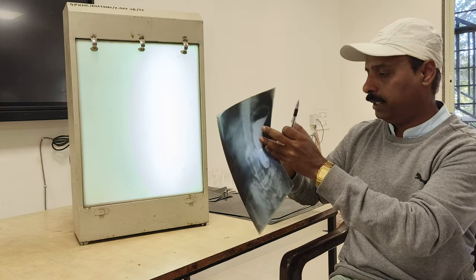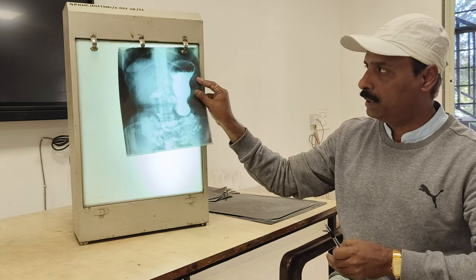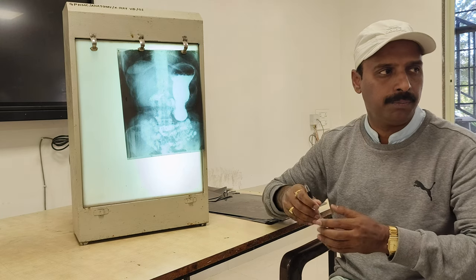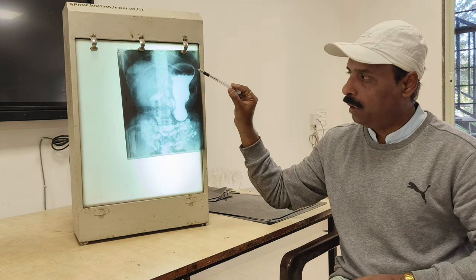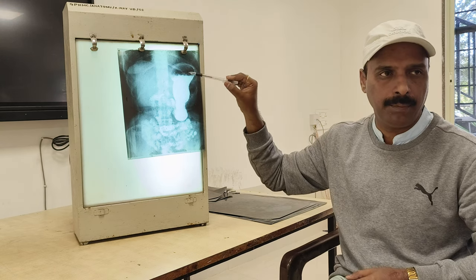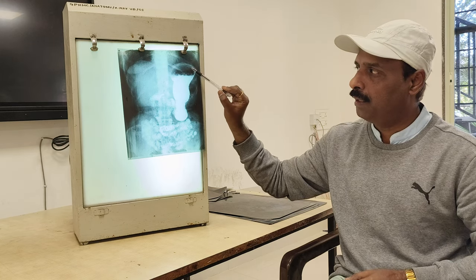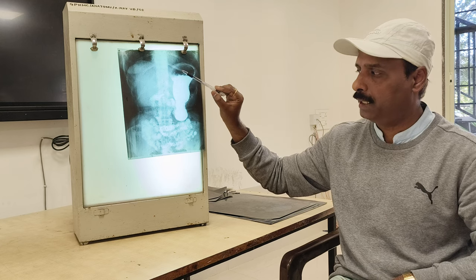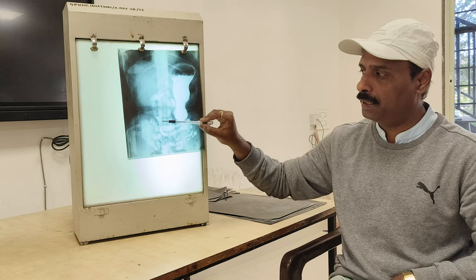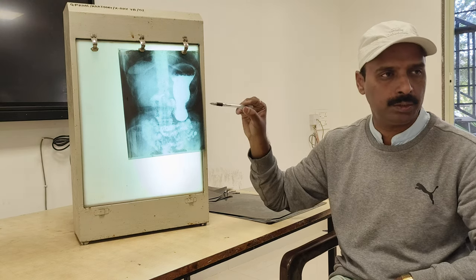When we go to the next one, this is also a barium follow through or barium meal x-ray. You can see how the stomach appears narrow, vertically. It should be oblique. Here you have the fundus, and you can see the gas here. You can see both domes of the diaphragm, one on each side, and the barium has entered the small intestine. So this is also the same.